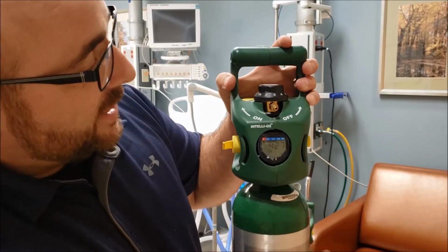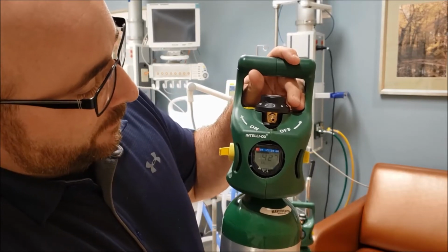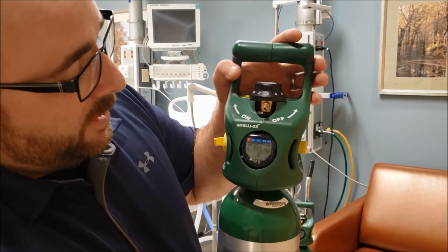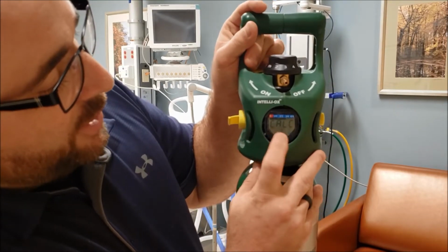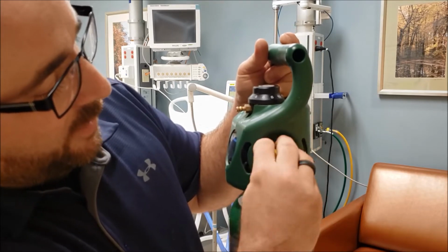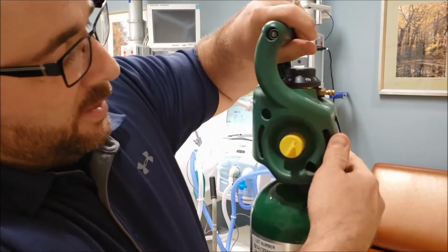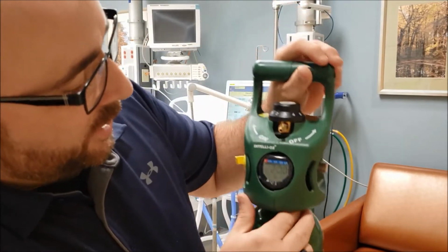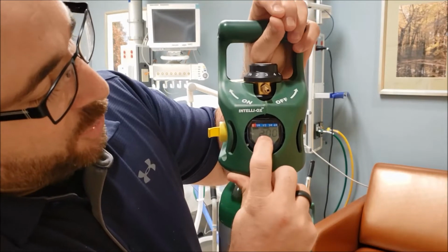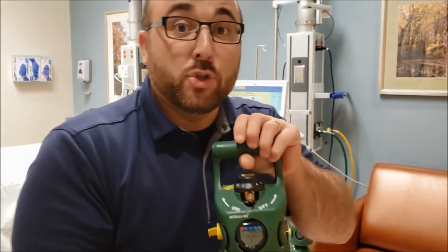So as this thing is letting flow out, you're going to see it calculate a duration. Calculating the duration right now. Other things, you'll see it says calc on here. You also have a hookup on the side for any kind of maybe port events or anything like that. There's also a hookup on this side, which is not commonly used. And if you look, this is in hours and minutes, so 2 hours exactly is how long this tank will last.